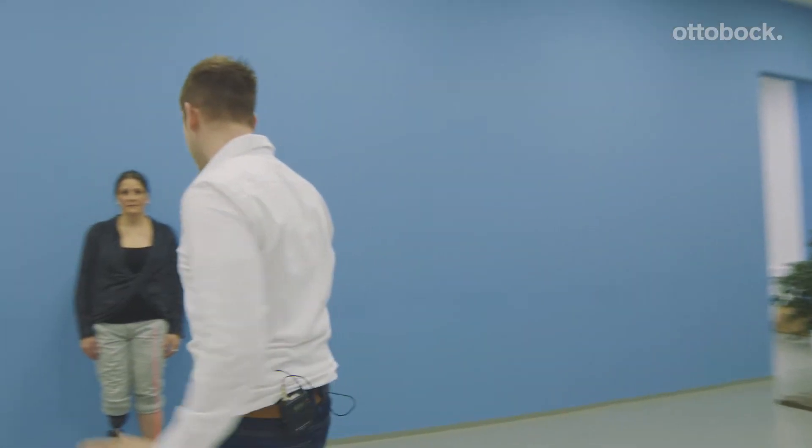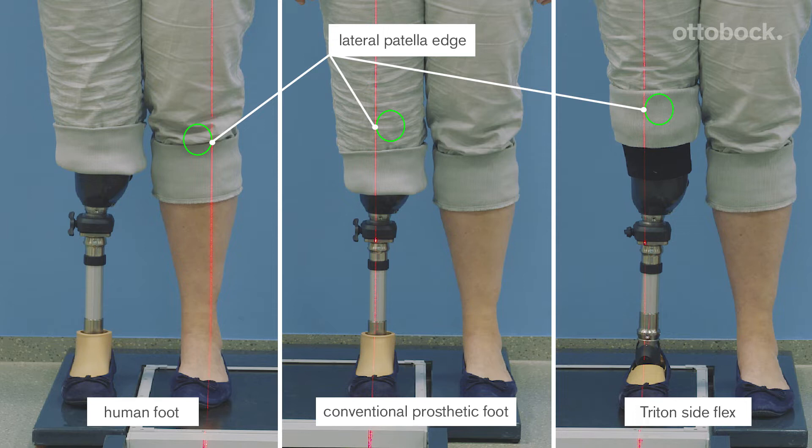Let's check now with Sibyl. Ground reaction force should travel through the human knee in a way that minimizes negative effects. With the proper alignment, this can also be achieved with prosthetic feet, like in these two examples.